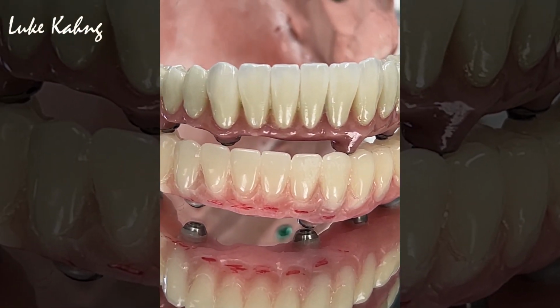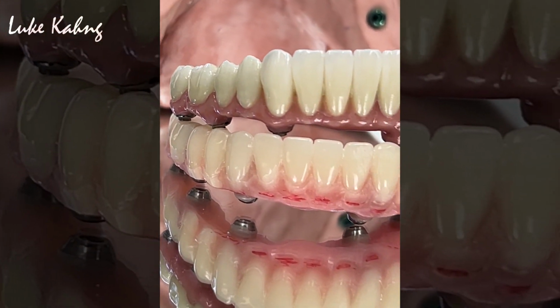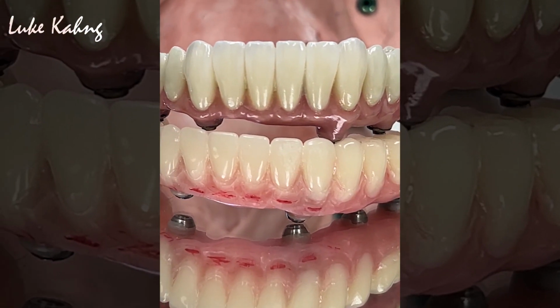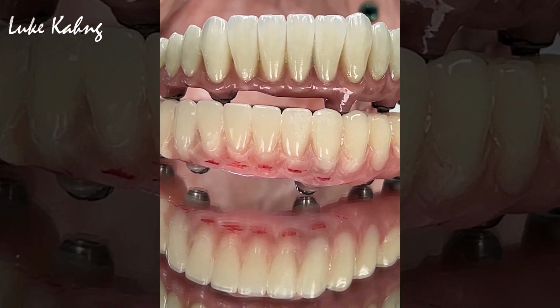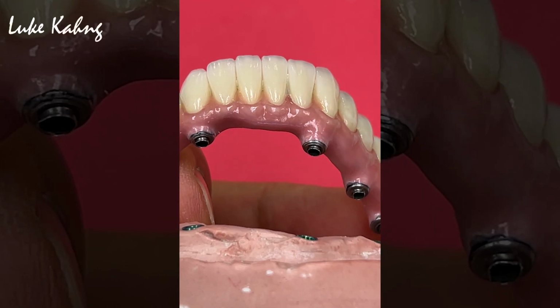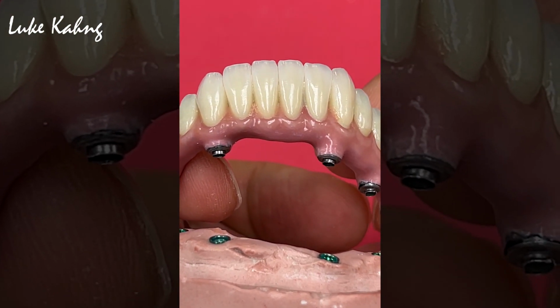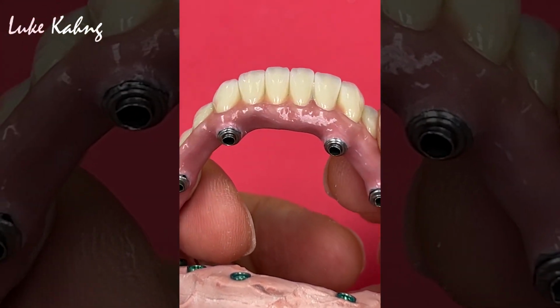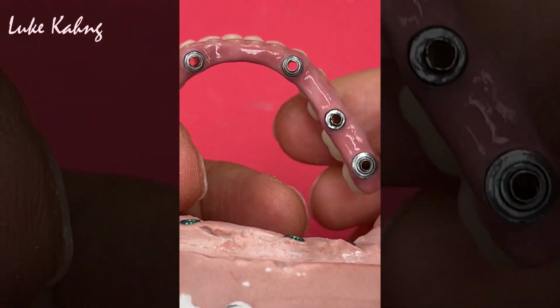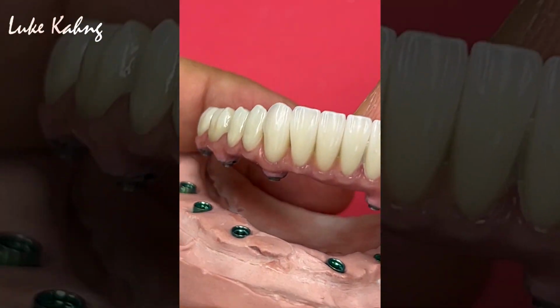This is a before and after from the PMMA, improving the gingiva contour. This is the final one. Now it's final. We have the cementation. Look at this, it's underneath the pontic. It's gorgeous. About 6 implants. It's very skinny, thin.